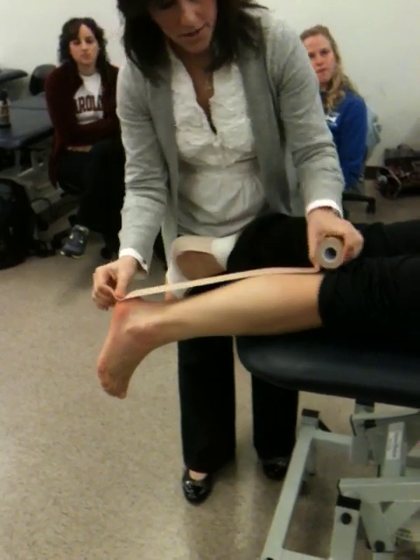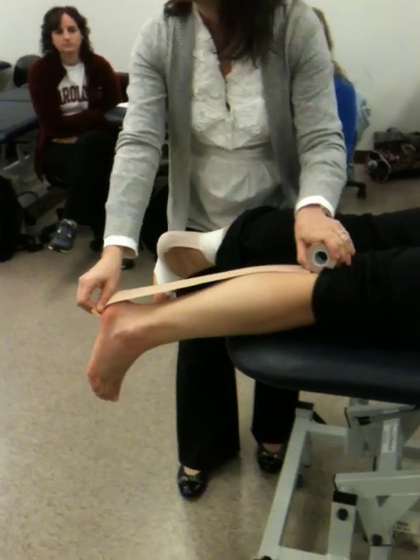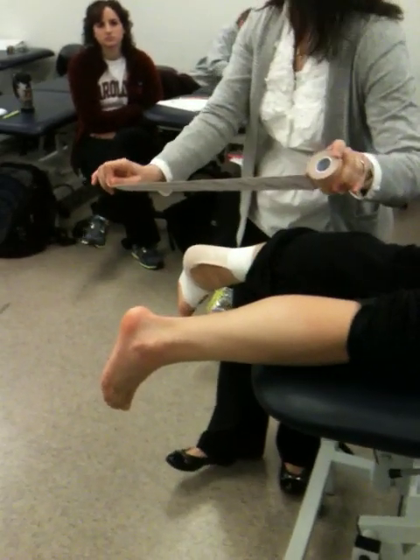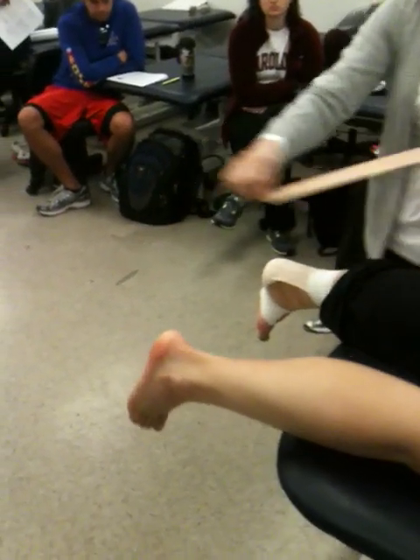In case you have it on the practical, I'll try to measure now. Remember, if you're facilitating you're going to take tension out so you don't need it as long, but if we're just laying it down I'm going to use pretty much the distance that I need.